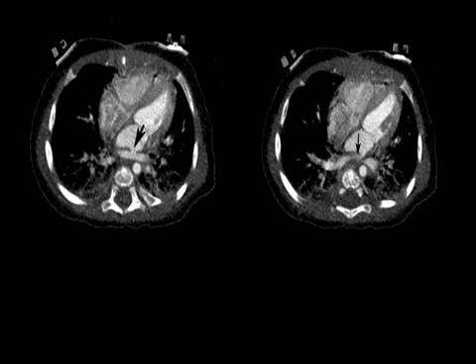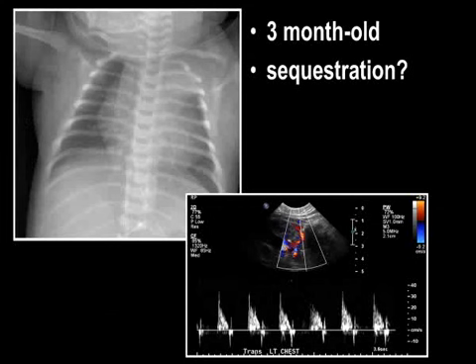This is not a gated cardiac study. For those of you who have looked at CTs, this anatomy ends up being quite good. And so for large vessel abnormalities, for origins of coronary arteries, for pulmonary veins, pericardiac abnormalities, we don't need to gate studies anymore. This is simply an acquired study with a non-gated technology, which decreases the dose.